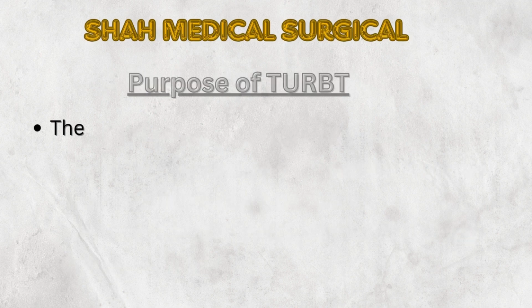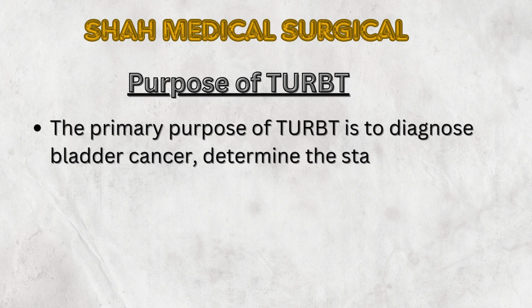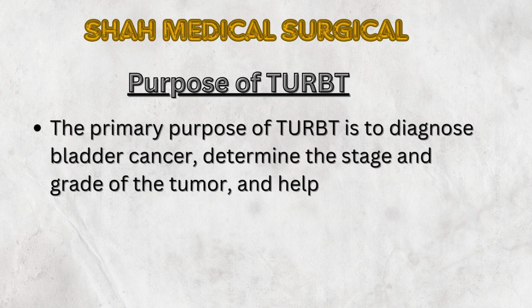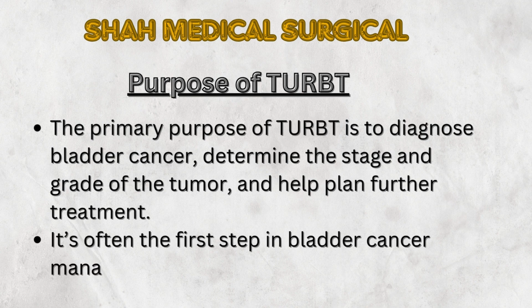Purpose of TURBT. The primary purpose of TURBT is to diagnose bladder cancer, determine the stage and grade of the tumor, and help plan further treatment. It's often the first step in bladder cancer management.